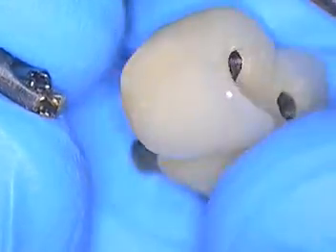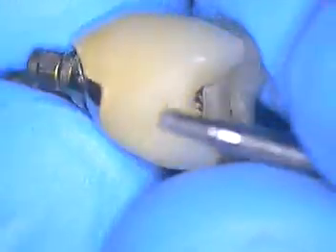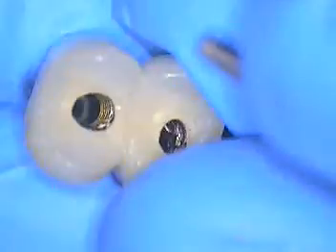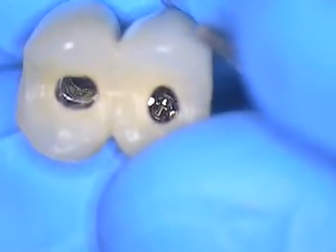So I've treated it a little differently — lingual access. I said buccal, but it is lingual. Too far lingually — you can see how that is. That's a little different.